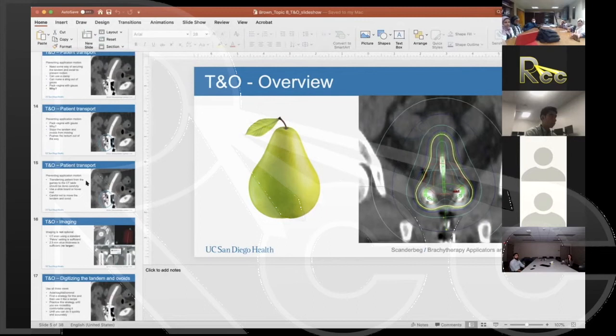One of the reasons I'm not a huge fan of it is that typically what we would do is fill the bladder, image the patient, and then release the bladder fill while we digitize and plan and measure the lengths, just so the patient can be more comfortable. But when we do that, we need to remember to refill the bladder before treatment. Given that it can be a chaotic environment, that's a very easy thing to forget, in which case the plan that you deliver is not the plan that you had planned. So from my perspective, if we can avoid using bladder filling, then we're in a safer space. But for some patients, it certainly does result in a more optimized dose distribution. Just very important to remember that you have to refill the bladder.